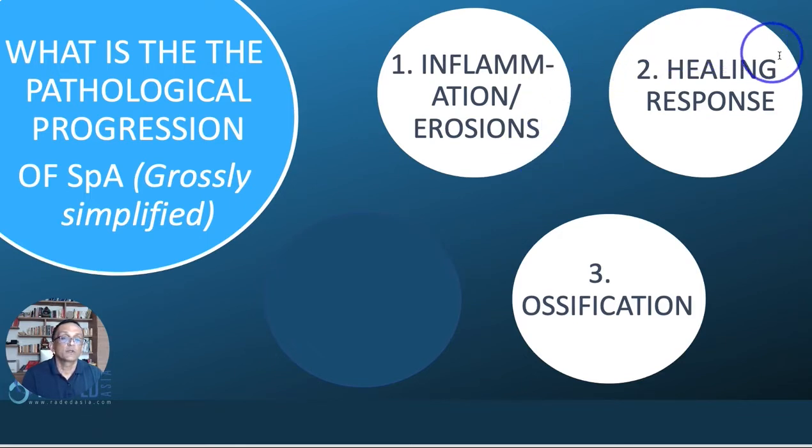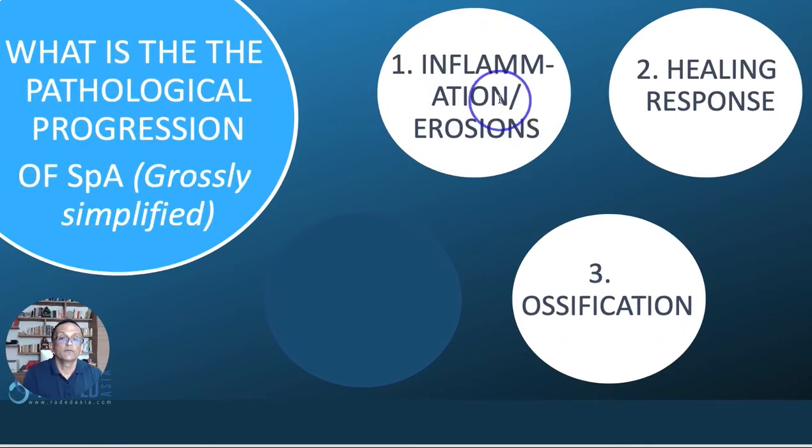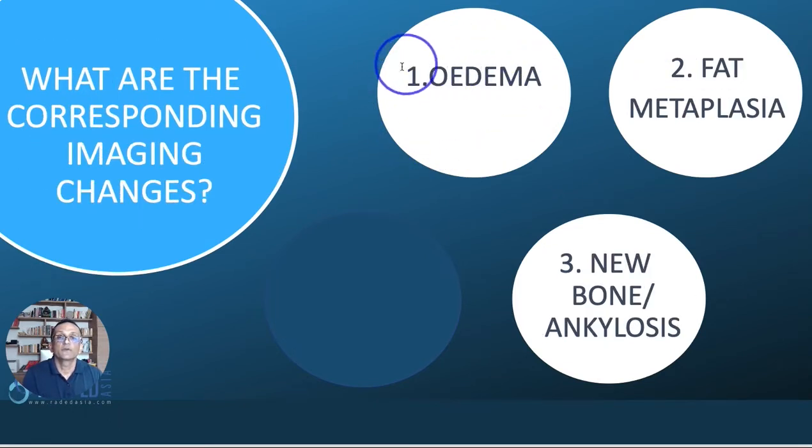Then subsequently with time, you get a healing response. And then eventually you may or may not get ossification. So the imaging findings also will reflect this. If we look at the corresponding imaging changes, when you have inflammation, what you will see on imaging is edema.